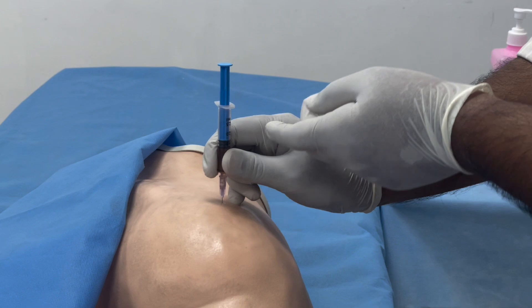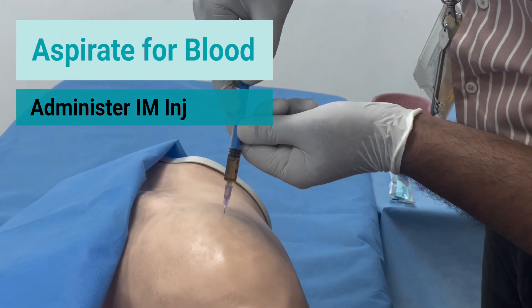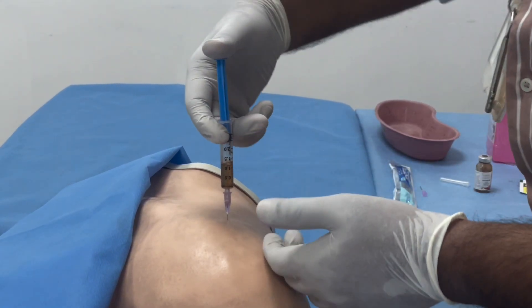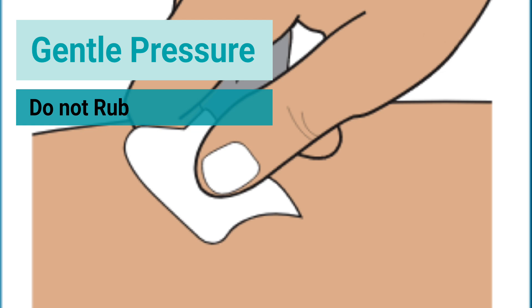Withdraw to see if there is any blood aspirated. If not, administer the intramuscular injection. Once this is done, gentle pressure needs to be applied, but make sure you do not rub the area.